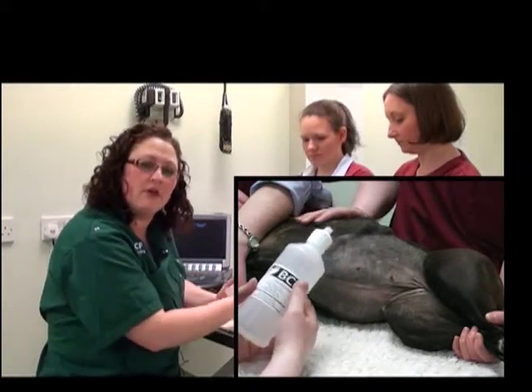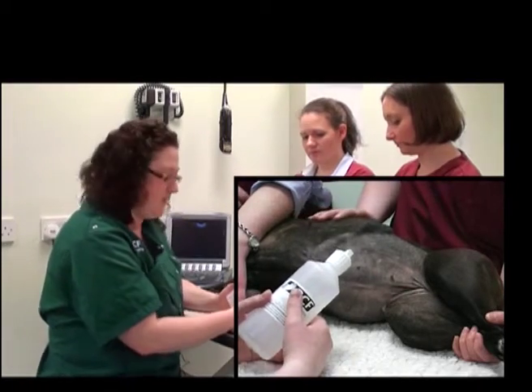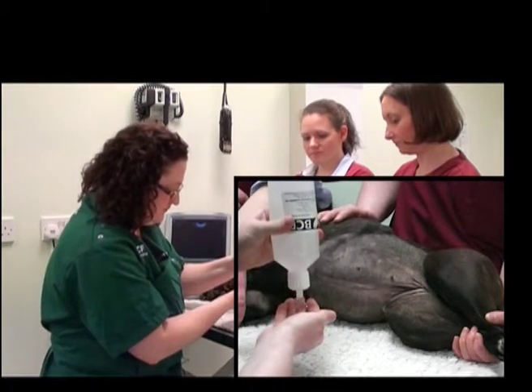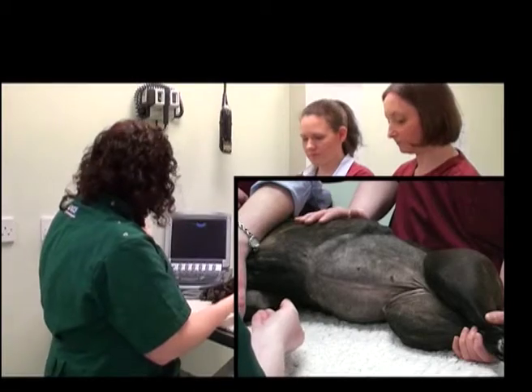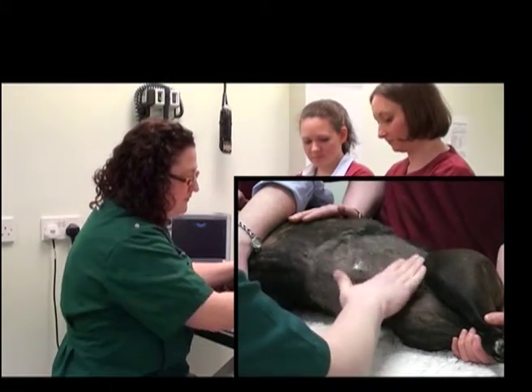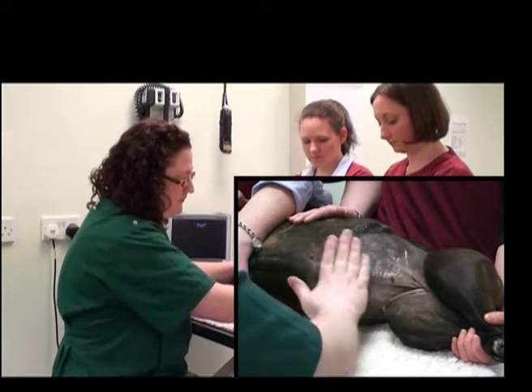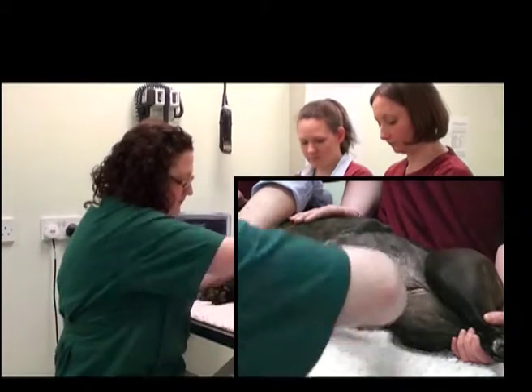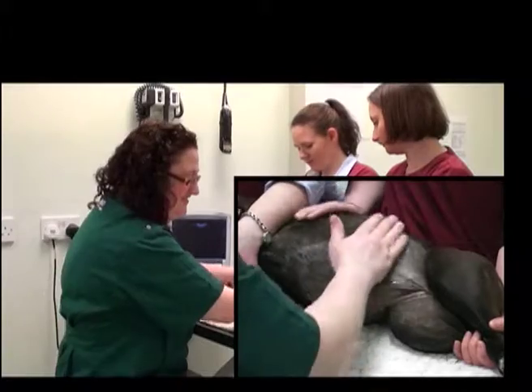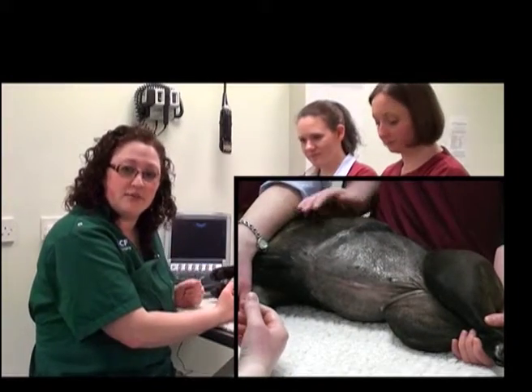You'll also want to use gel throughout the examination to top up. It can help if you warm it up a little bit first too. Now we're ready to start our abdominal ultrasound exam.